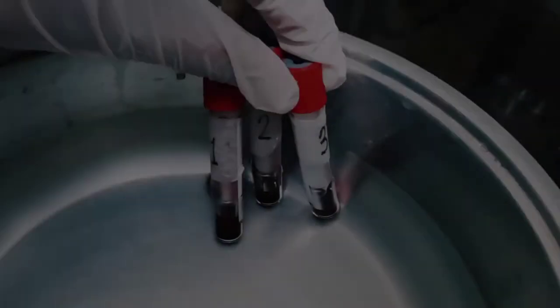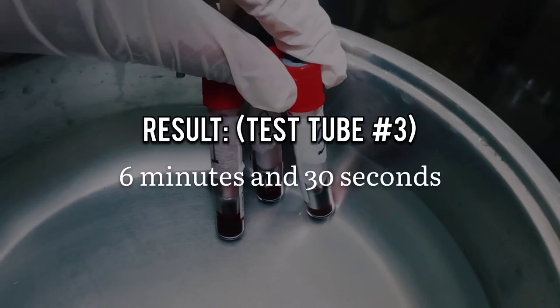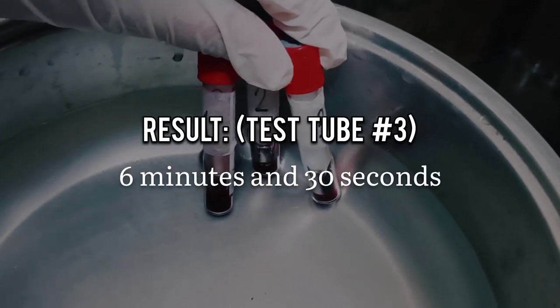Since agitation and handling speed up coagulation, the clotting time of tube number 3 is the reported result.